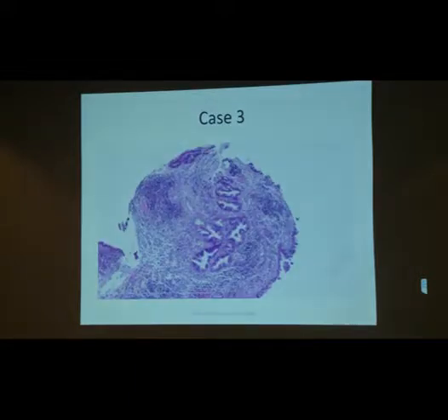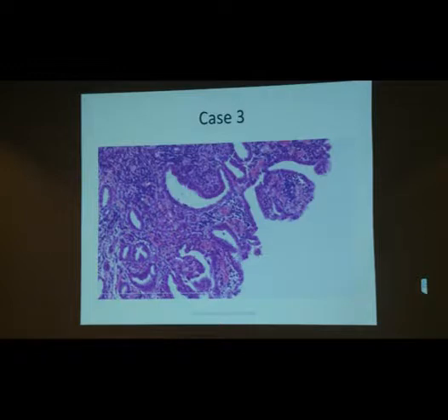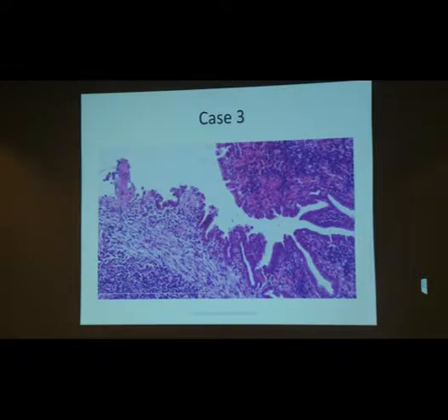I'm going to give you a higher power. Here they are again, a little bit haphazard. Would you say they're haphazard? They're not evenly distributed, are they? Higher power. Again, now we see that the blueness of the stroma is due to lymphocytes and plasma cells floating around. But again, you're seeing this kind of thing on the surface. So there is some discohesion. Again here to show you the epithelium lining this polyp, some cells falling off on the top.